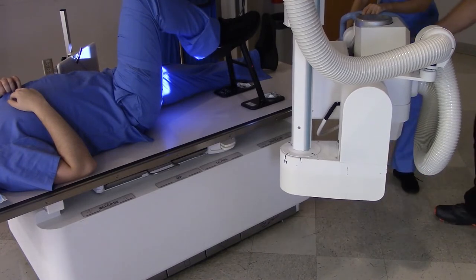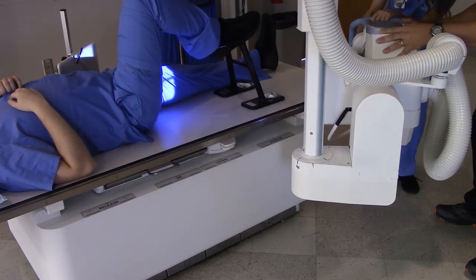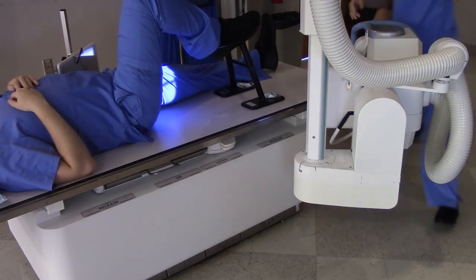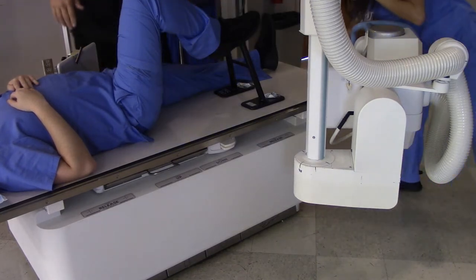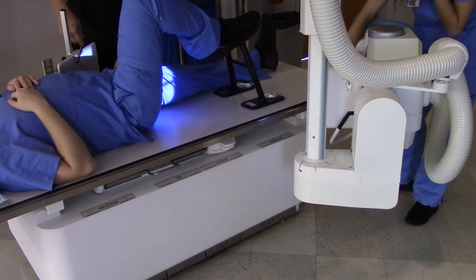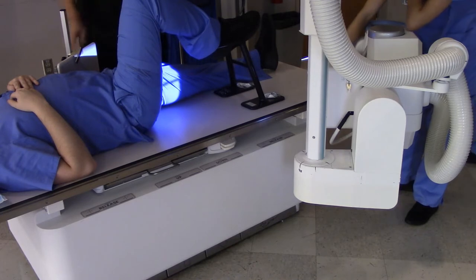Yeah, I'm just visualizing what happens. There you go. You're doing it. That's good right there, Ms. Delaney. Now open your collimator out a little bit, lengthwise. Top to bottom, you're good.